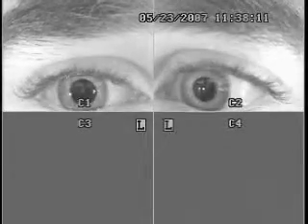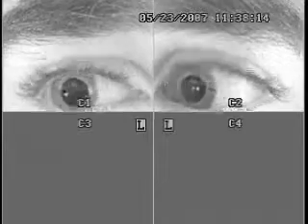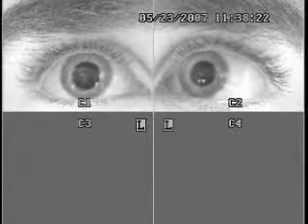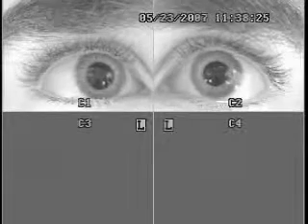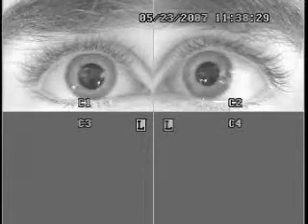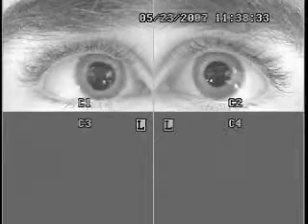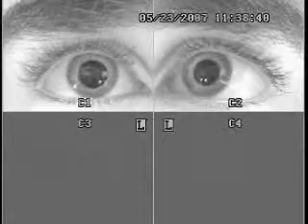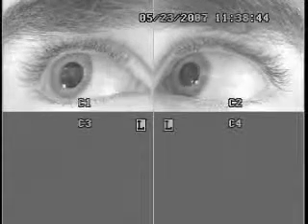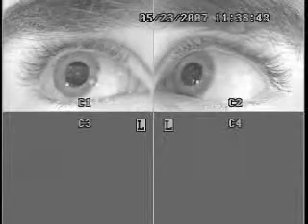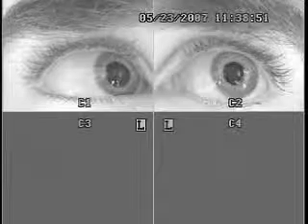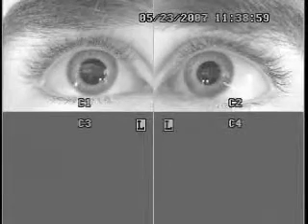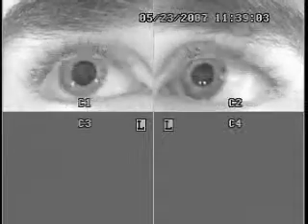As the last piece, we'll just check for optokinetic nystagmus. If you can see the stripes there on the drum, just follow the stripes with your eyes. So, we have optokinetic nystagmus in one direction, and in the opposite direction. Now keep looking at the stripes. Now look at the red bead in front of the stripes. Look at the stripes. And look at the red bead. Keep following the red bead. And now look at the stripes. Great. Thank you very much.